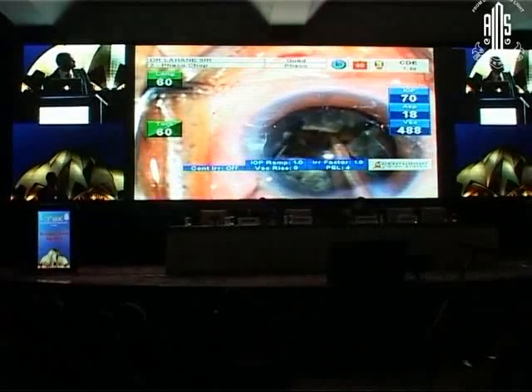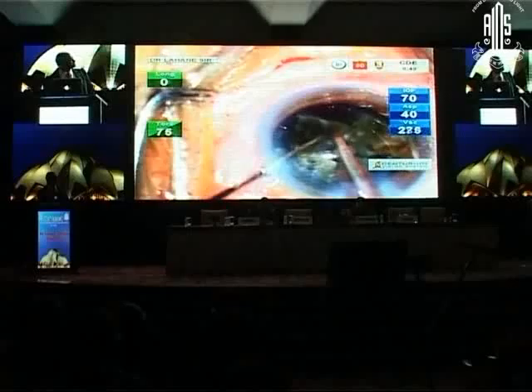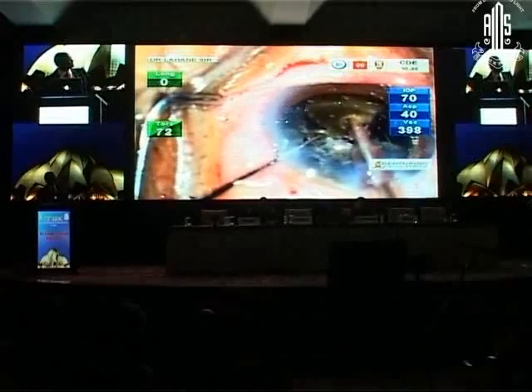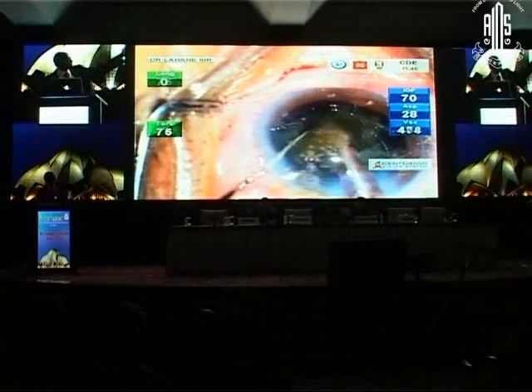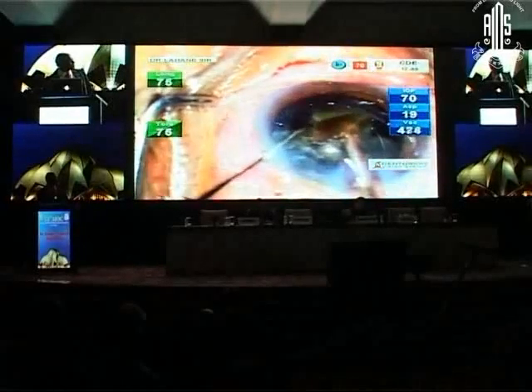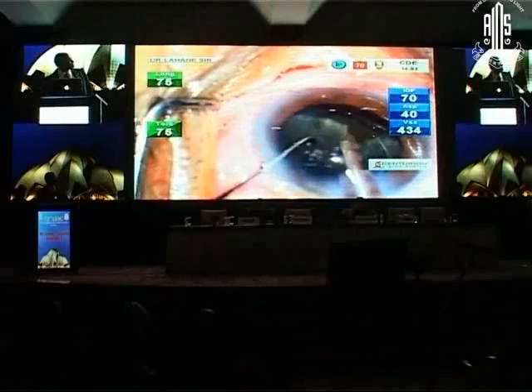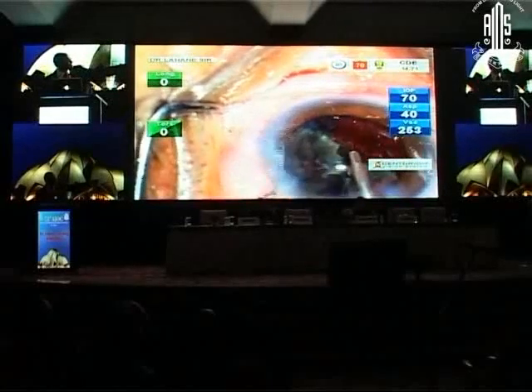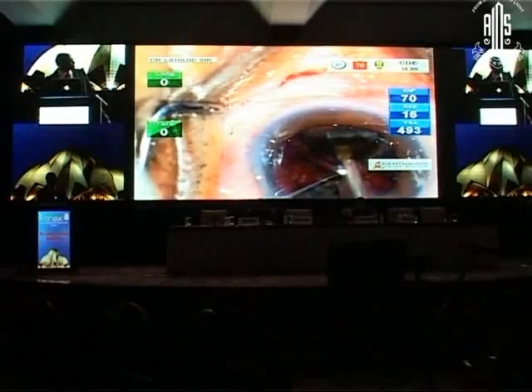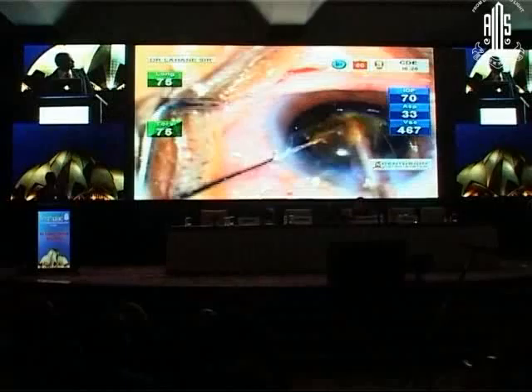See this, and then as everything is separated now I am lifting the piece. You can see the piece is lifted, and this is the followability. It means the piece is coming to the tip. The piece is coming to the tip, and you can see the vacuum there, and because it is going to 490 you can see, and the aspiration, so you can see how the vacuum helps you for this. Now once I am again rotating it, and see they were not separated. I separated it because of those leathery fibers.